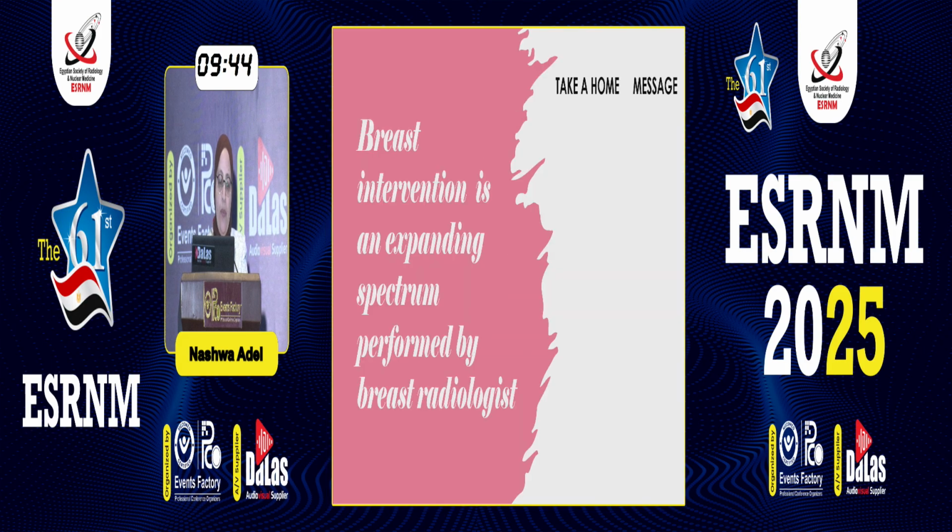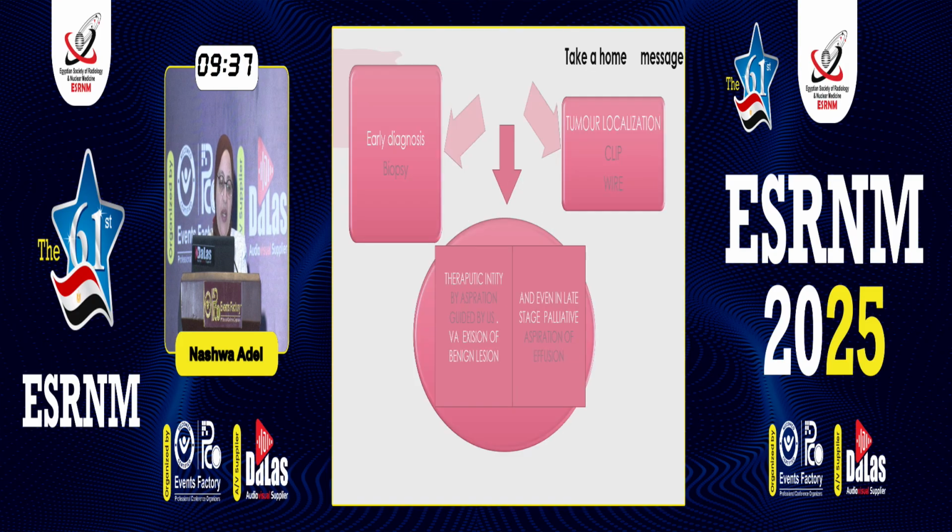And to conclude, breast intervention is an expanding spectrum performed by the breast radiologist. It includes early diagnosis by biopsy, tumor localization with a clip during radiotherapy, and wire localization for the surgeon. Also, it includes therapeutic intent for aspiration or drainage guided by ultrasound and vacuum-assisted excision of the benign lesion. And even in late stage, palliative intent is used for aspiration of the effusion.